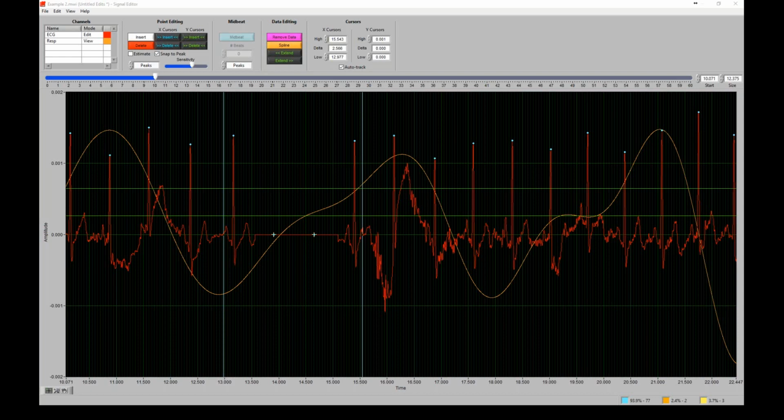Okay, and then last question that I have in here today is, what should we do if the first peak in a section is yellow? So if the very first peak in a segment. In that case, you can just delete it. You don't necessarily have all the information you would need before that segment to confirm that it is in fact good or potentially artifact. Occasionally, this will happen just as a result of the artifact detection algorithms seeing something that does look normal.